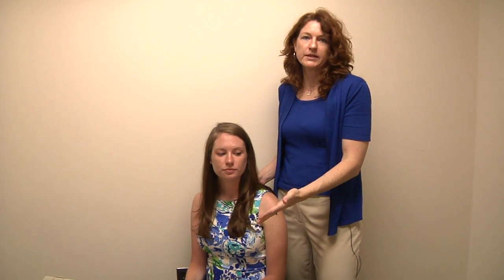Notice what happened here. Amanda was able to raise her hand every time that Laura pressed the button, even though there are no tones coming from the audiometer, because she can see what she is doing. If this were an actual hearing screening, Laura would then mark pass on the form, even though there were no tones. So you have to be very careful about the way the screening room is set up.